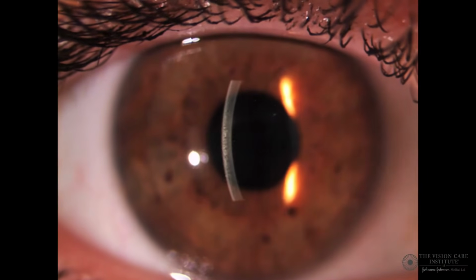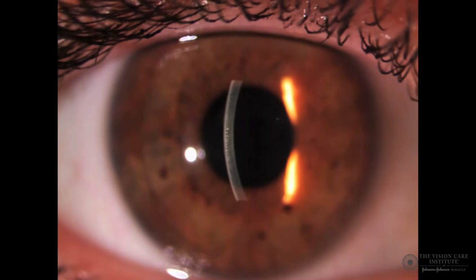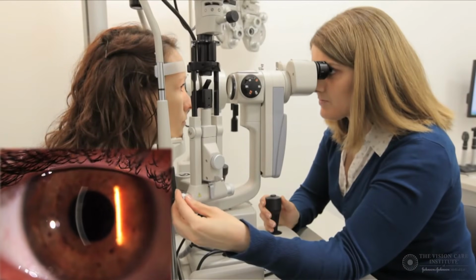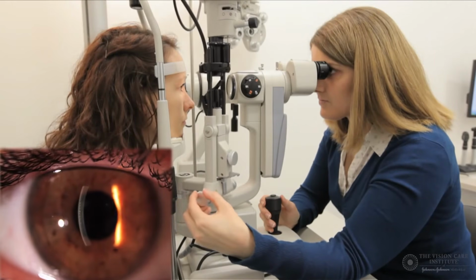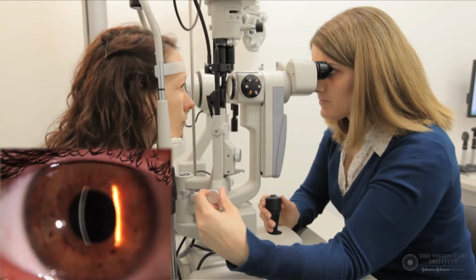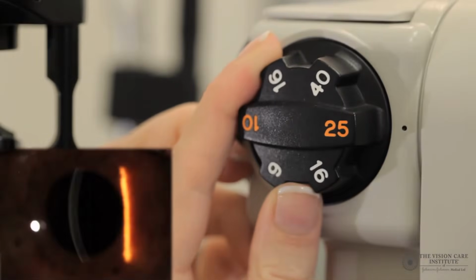We need to bear in mind that we can make the section look thicker or thinner by increasing and decreasing the angle between the illumination and observation systems. As we increase the angle here, we can make the section look broader, and by reducing the angle, we can see that we can make it look thinner. By increasing the magnification further, we will be able to see the layers a little more clearly.